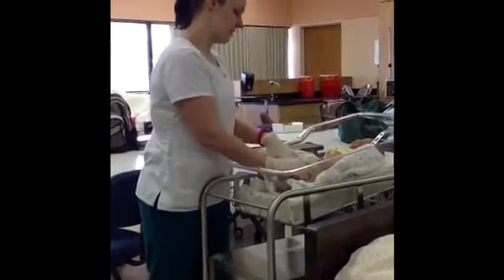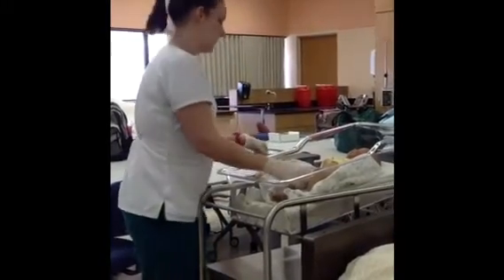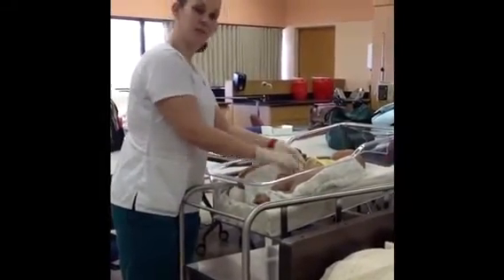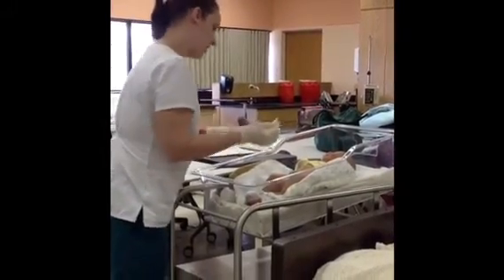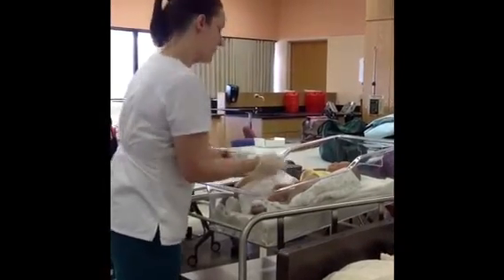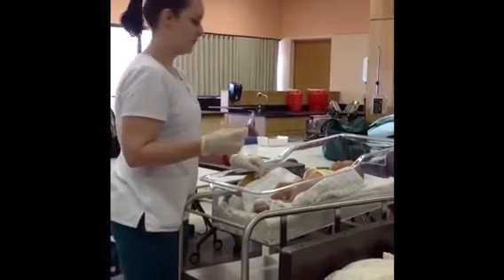So I'm looking at the baby's leg. I'm going to use the right leg for this injection. And I'm going to visualize the thigh in thirds, and I know I'm going for the middle part, the vastus lateralis. So I will find the spot that I need and clean it with alcohol. Okay. Let it dry for a moment.